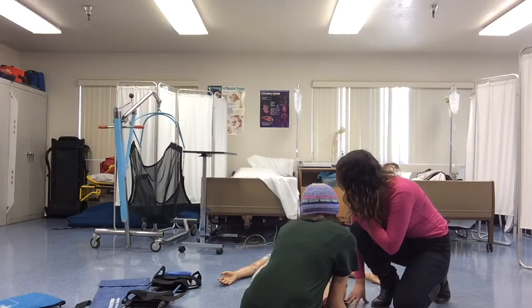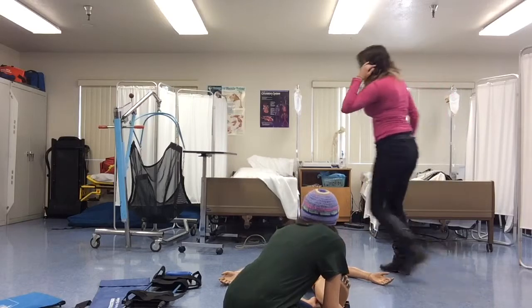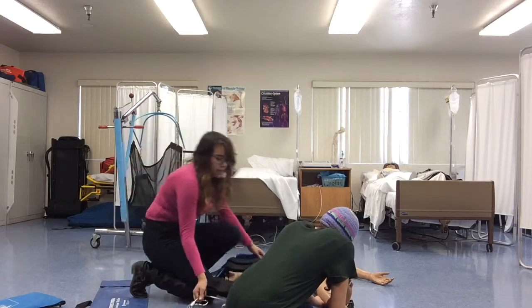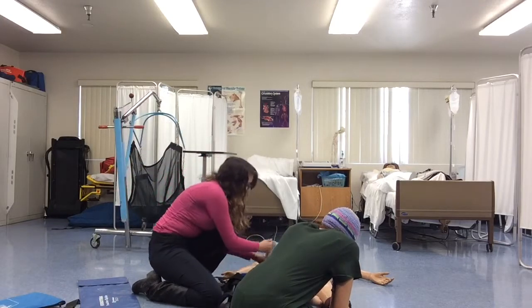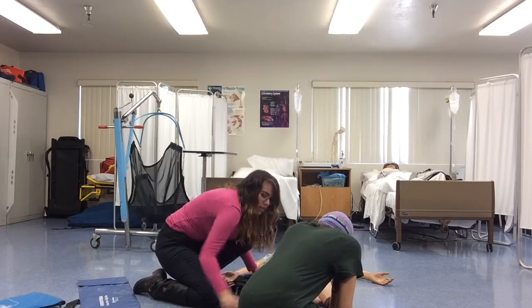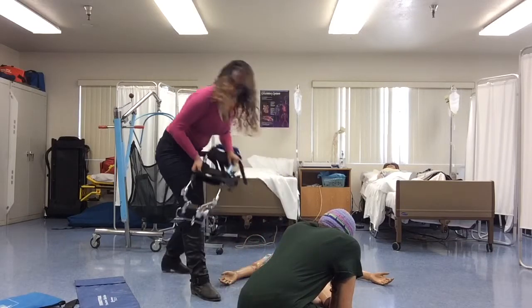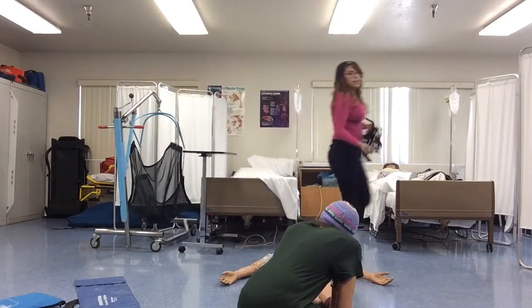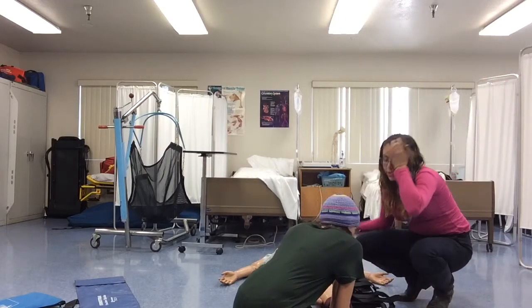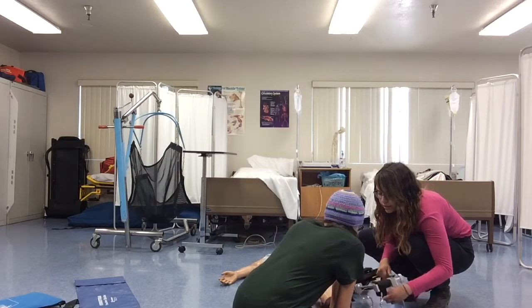Okay, that feels so much better. Yes, ma'am, it will help. And then I'm going to measure the splint on her uninjured leg. Okay. Making sure that the bottom is 8 to 12 inches from the heel. Okay, that's good. So this is one. Okay, so now that I measured the splint, I'm going to put the heel down.